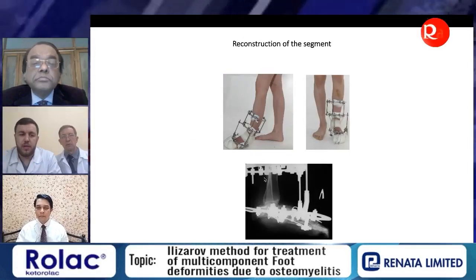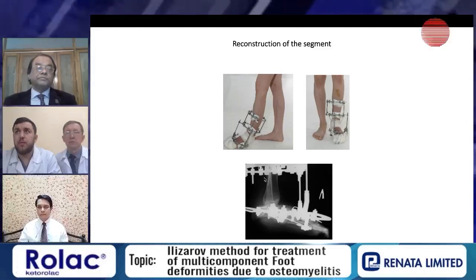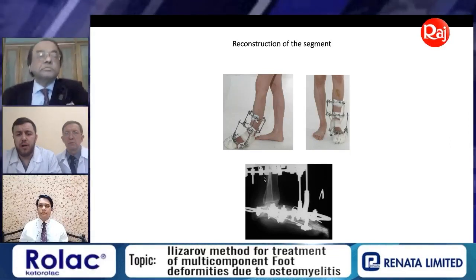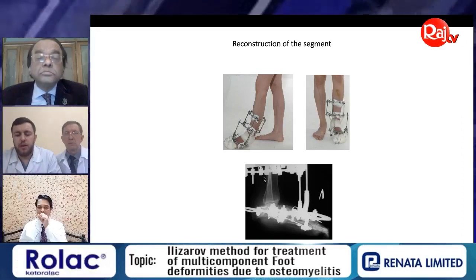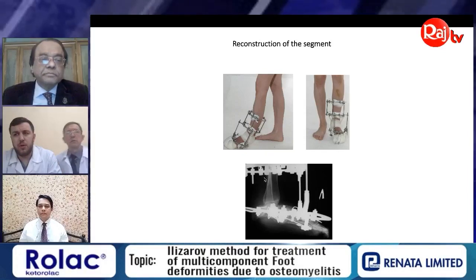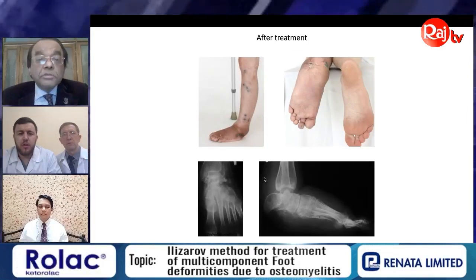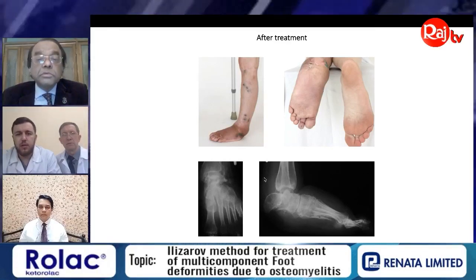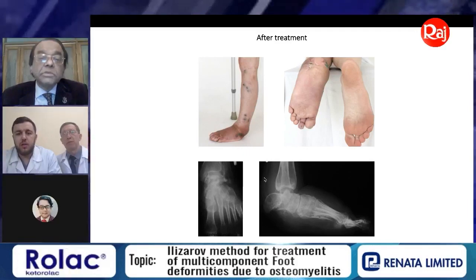And for reloading of the scar after wound stitching, for that patient we made reload of the plantar surface by changing the points of pressure on his foot. We made it by transporting the foot backwards on the hindfoot here. After treatment, the patient has no recurrence of infection, can walk with full pressure on his foot, and importantly the scar after the ulceration place is reloaded.